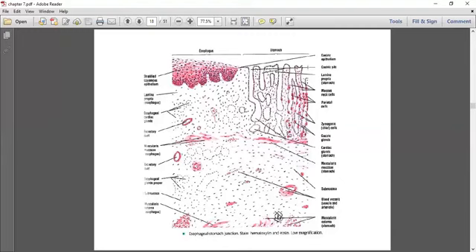The last layer, adventitia in the esophagus. At the junction here, there is addition of another tissue layer, which is simple squamous epithelium, to form what is known as serosa. In this slide, it is not clear.